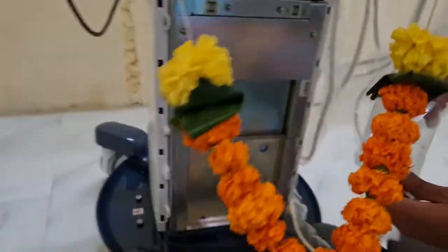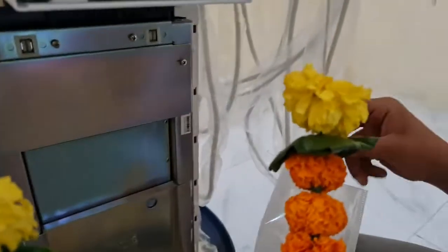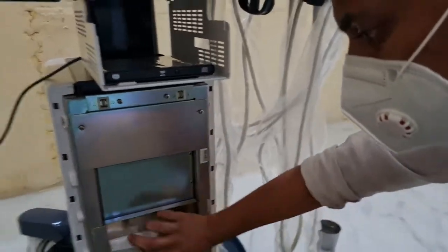This is your software dongle. This is your machine's software dongle. You have to keep it very safely. If your machine software is getting corrupted, this will help you.